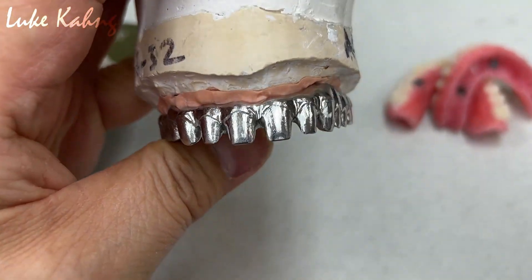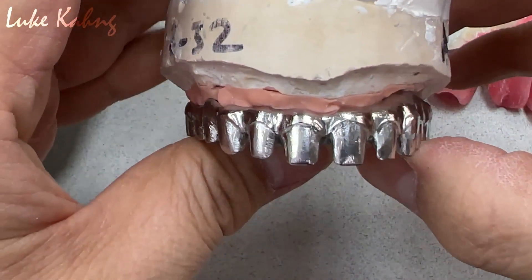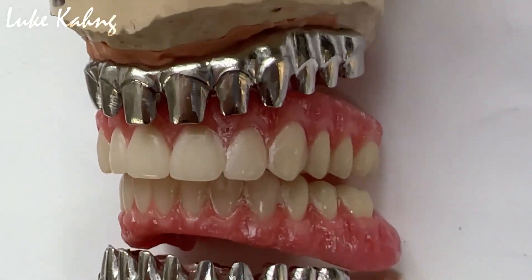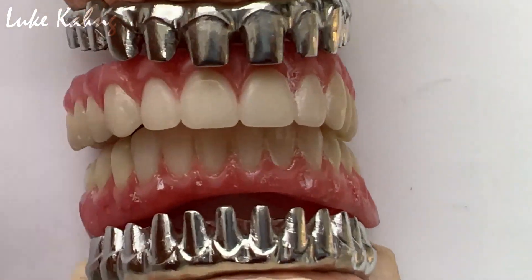Then we can finish them up after we opaque — like the contour of the tooth. We make sure the measurement from the incisor and the lower teeth is correct.